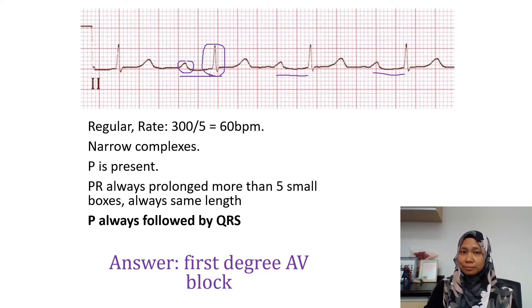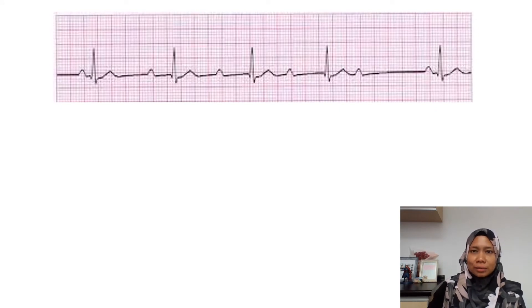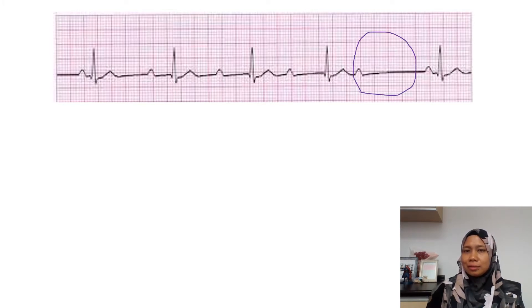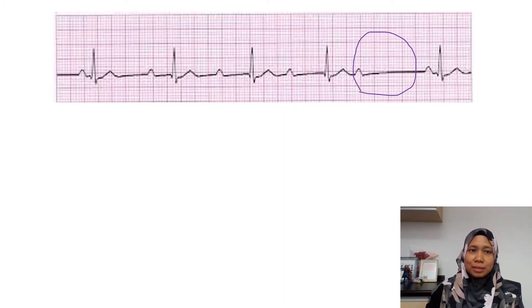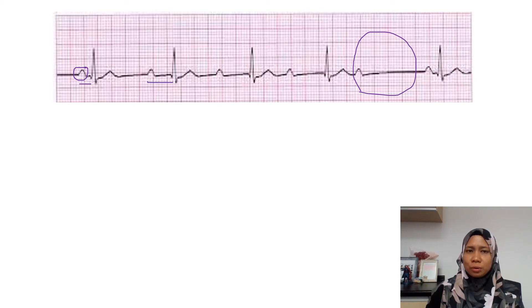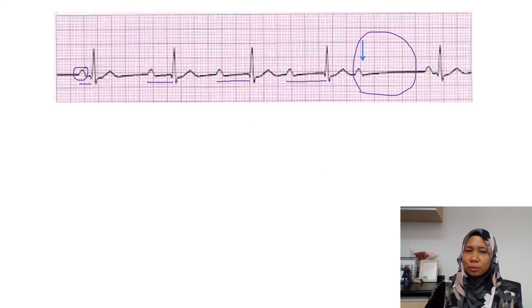So now let's go to the next one. Here we can see that it is regular, but suddenly there is no QRS complex — this is what we call a missed beat. So we can see it is a regular rhythm with narrow complexes. We look at the P wave — the P wave is normal in shape. Then we look at the PR interval. The PR interval is prolonged, then it becomes more prolonged, and then very prolonged, and suddenly it stops — there is no QRS conducted. So this is what we call the Wenckebach phenomenon.